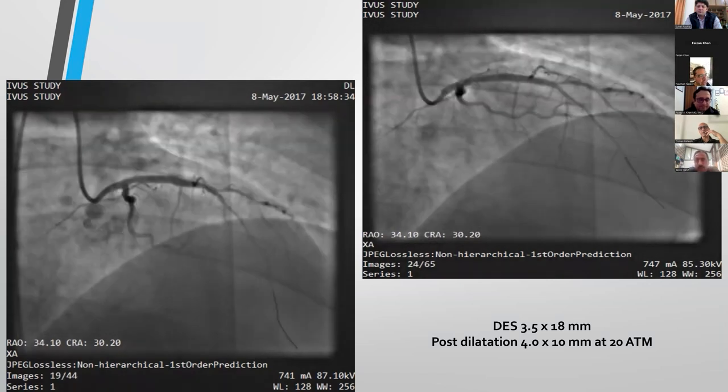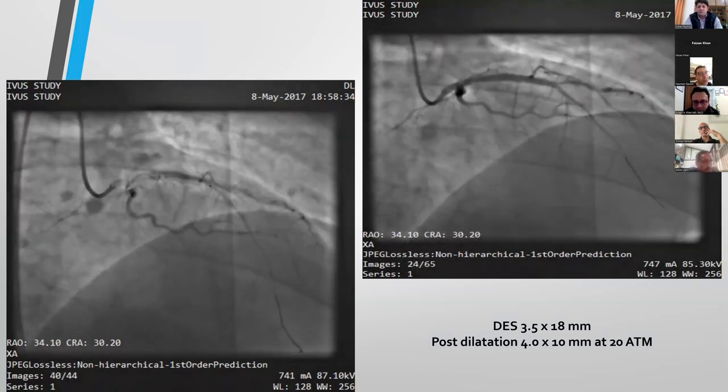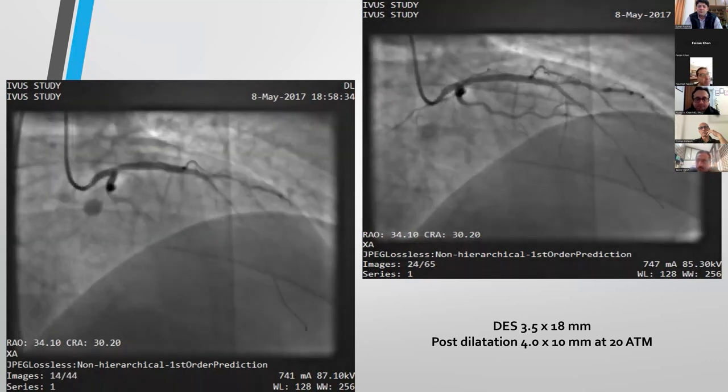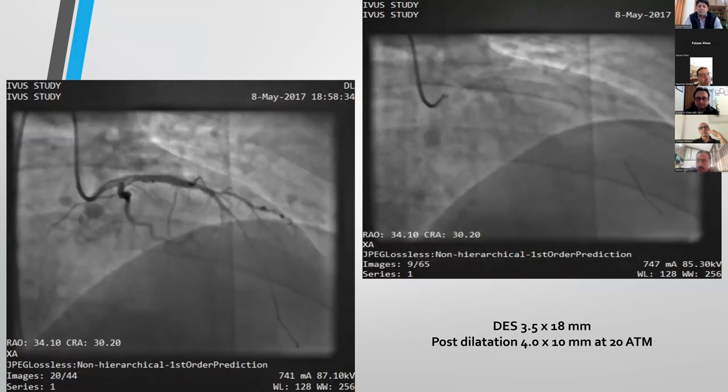So for a stent which is really undersized, जिसमें इस तरह था कि stretching a 2.5 to a 4.0, there's a very high likelihood that it will fracture, and so that's why we went with another stent over there.